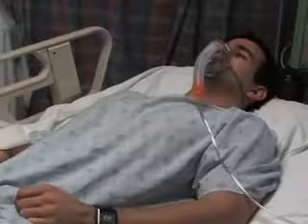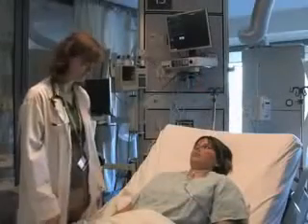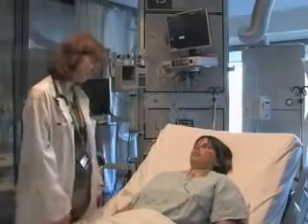Arterial blood gas sampling often takes place in an emergency setting and may not allow for obtaining consent from the patient or next of kin. When possible, the procedure should be explained to the patient and consent obtained.